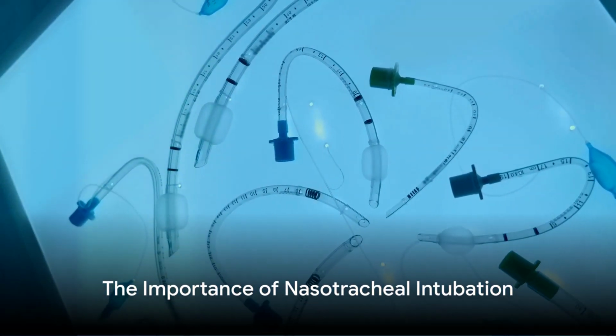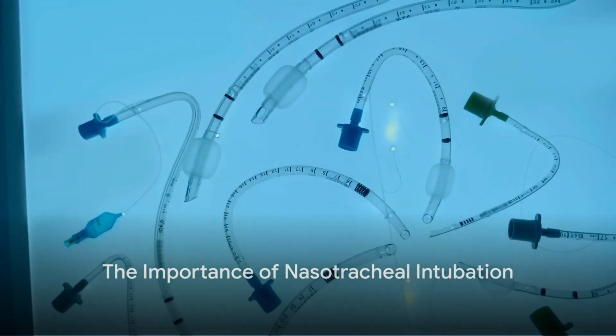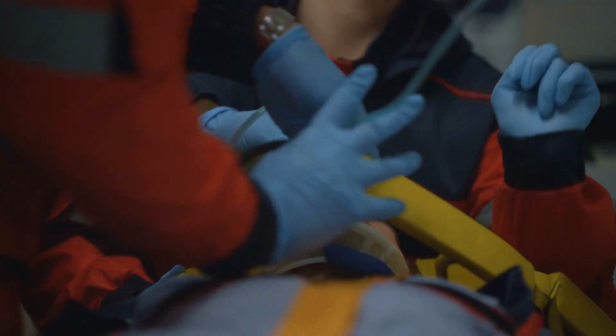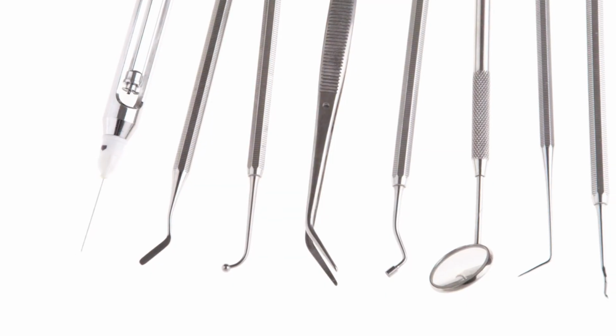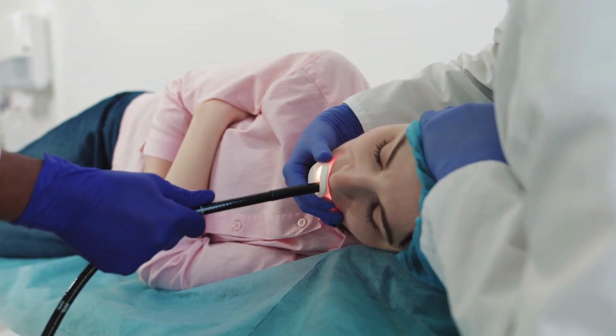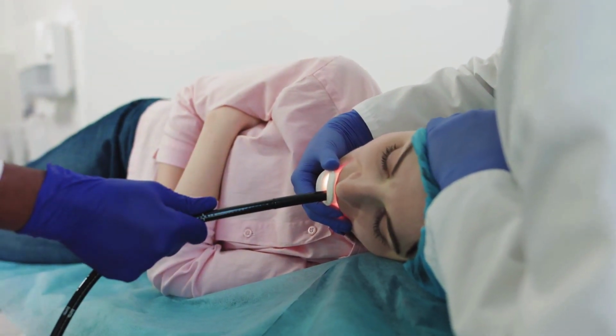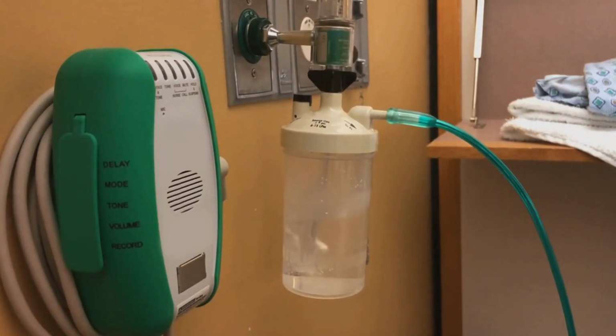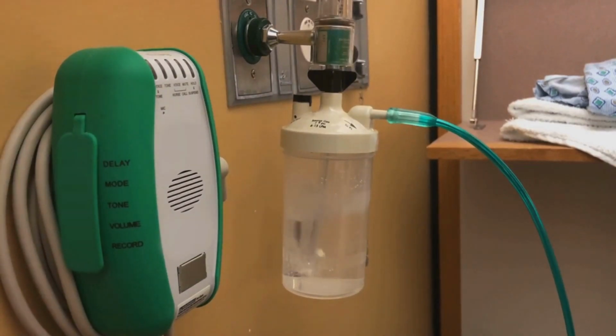Have you ever considered how crucial nasotracheal intubation can be in the field of anesthesiology? This procedure, often overlooked, plays a vital role in medical scenarios where oral intubation isn't a viable option. Let's take oral or maxillofacial surgeries, for instance. Here, the oral pathway is often obstructed or needs to be kept clear for the surgical procedure. That's where nasotracheal intubation comes into play, providing an alternative pathway for ventilation and oxygenation.